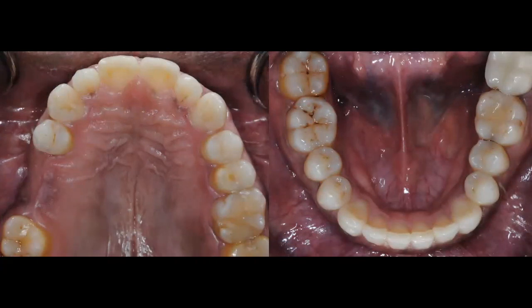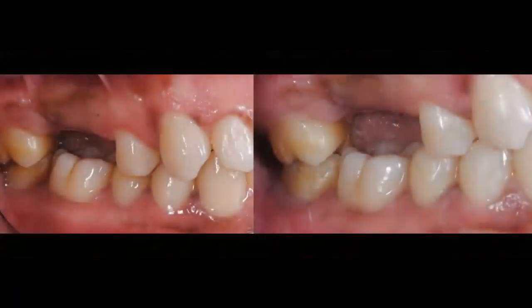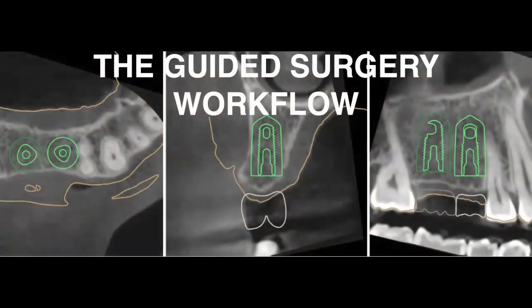She was able to close that diastema. She was able to push the laterals and align them a lot better. She was able to give me a good mesial distal distance between the premolar and the molar, so that I can go ahead and place 2 implants there. And she was able to increase vertical dimension to actually improve the interocclusal space that I had on that site. So now I'm ready for my guide.